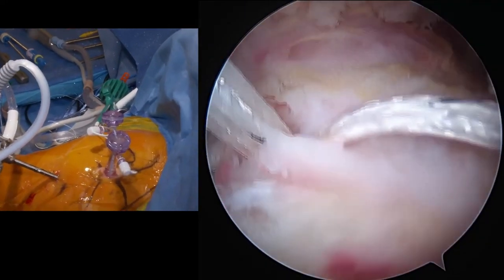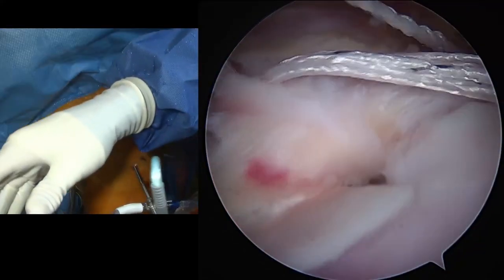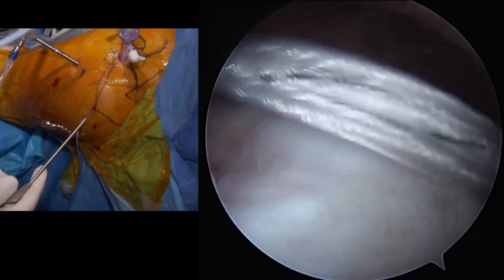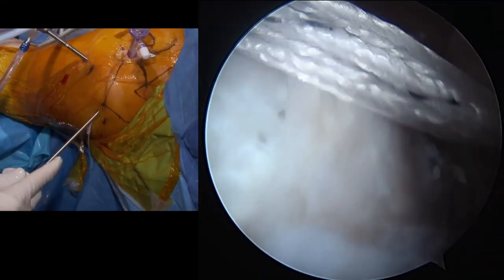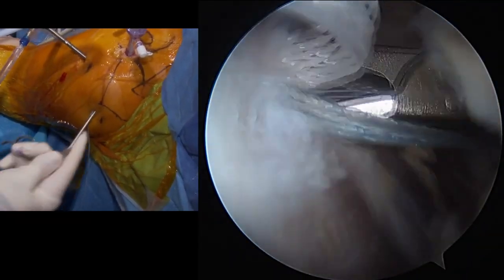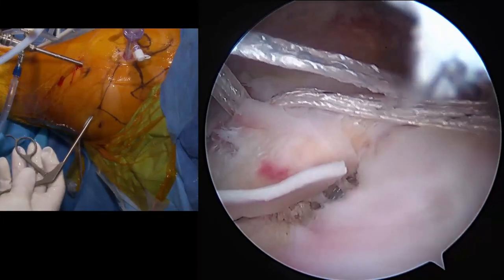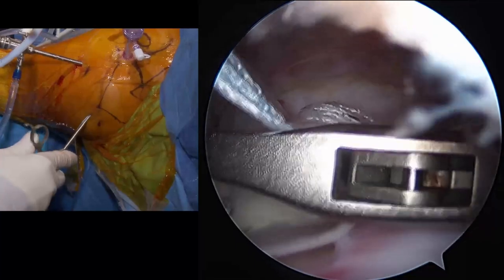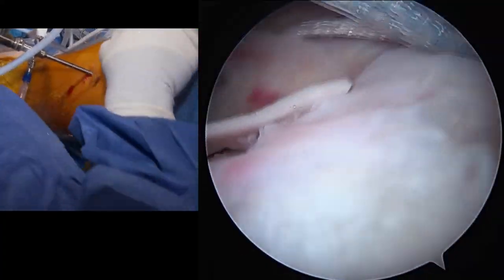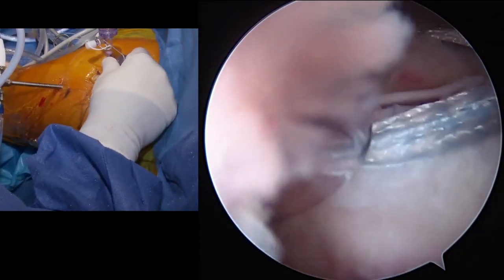Good. And let's just lower this just a little bit so I can see that corner. There we go. And let's get our white one out of the way. So the fiber tape retriever again, please. So we don't want it to be trapped by the blue, so we gotta pull the white one out from underneath. Do our somersault. There we go. All right, so that's out of the way. And then we just wanna have this here, a good position at that front edge. We wanna make sure we come all the way off that front edge of the supraspinatus, so that looks like about the right position. So we have our punch.